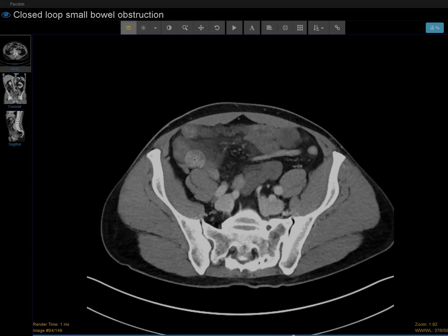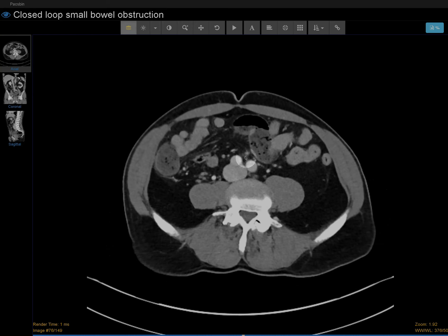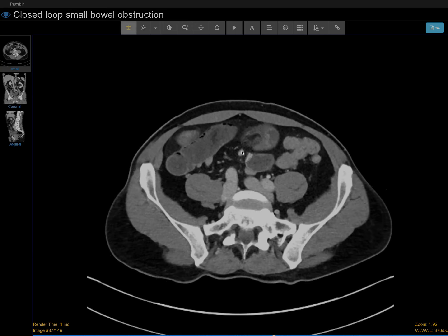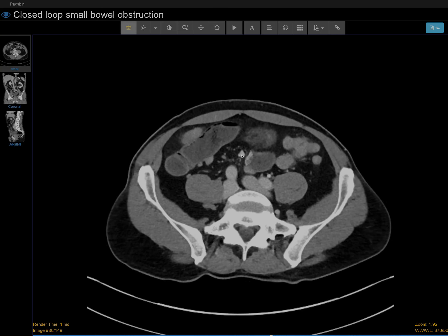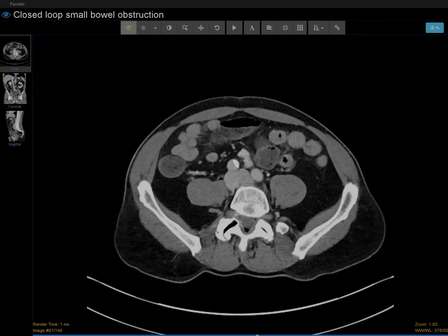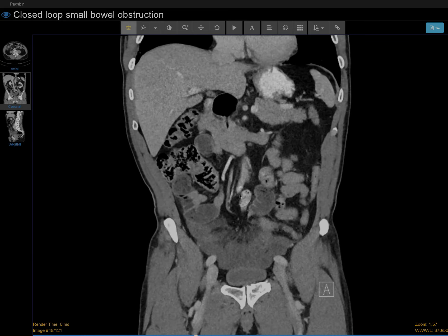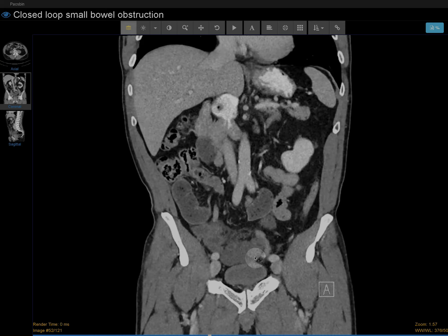Around here it's hard to follow because the bowel loops all blend in. But this was one loop and then the other one was right here. From here this is the proximal bowel loop, and this is the distal. The area where these bowel loops are being pinched off is right here — imagine there could be adhesion going here. This is the proximal, this is the mid portion where the bowel loop comes out, and this is the distal bowel loop. This is a closed loop obstruction with abnormal enhancement of the bowel loop, concerning for ischemia.